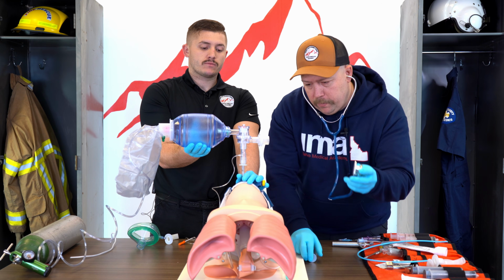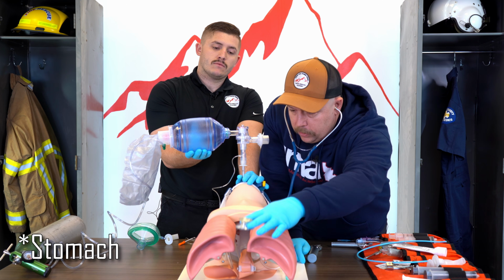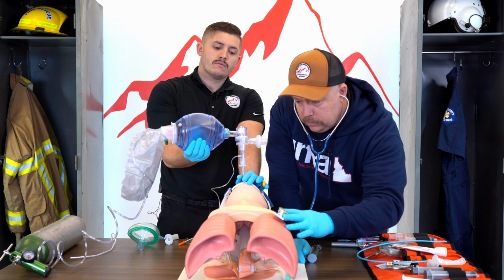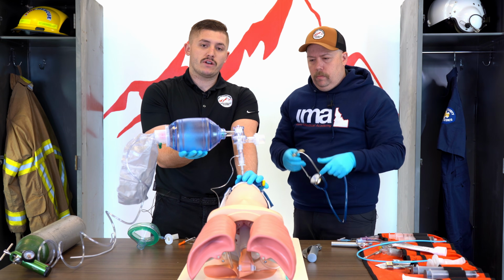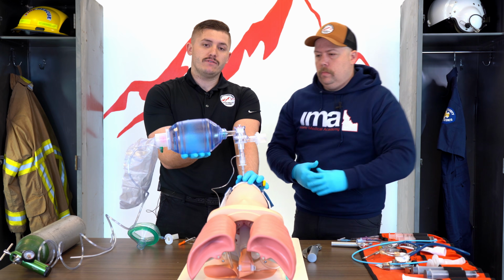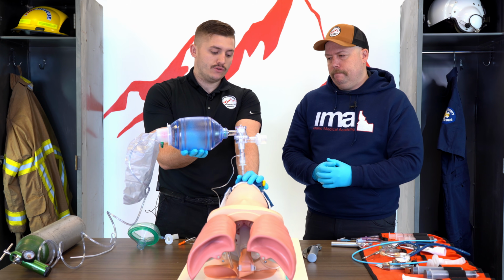All right, so more confirmation. We're going to come down here and confirm we don't have any air in the stomach. Give me a breath. Nothing there, and we'll check both lungs. Breath, please. One more. It's okay to give breath after breath in this case, because now we're confirming that we're in the lungs. I don't have to wait 5 seconds between each one just to confirm that we're actually getting air into the lungs.